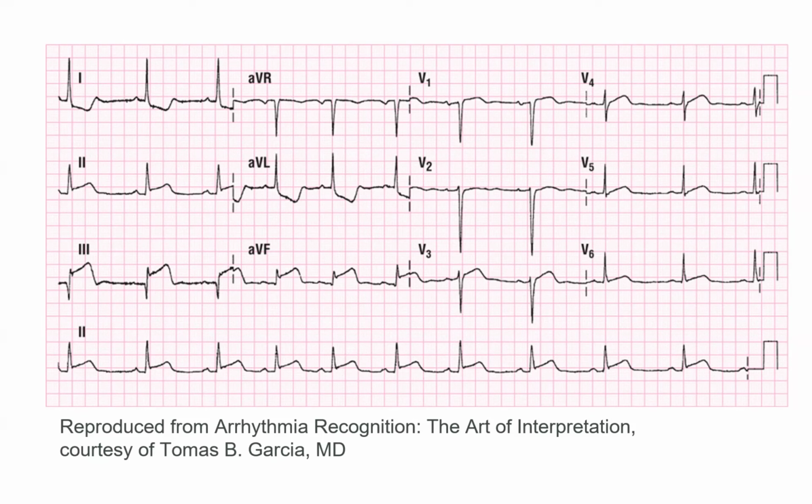Show me the elevation here in 3. The fact that you think I can reach that. Point to the J point. You got it. Where's the J point now in 3? Any one of those beats. Oh, you want me to point? You really can't. Where do you want, which way? Right there? That's the J point.